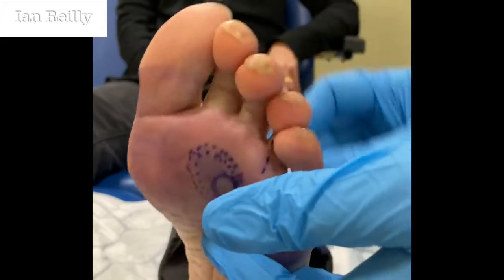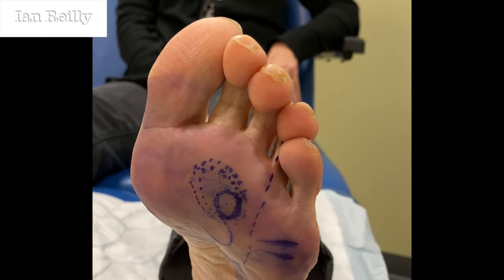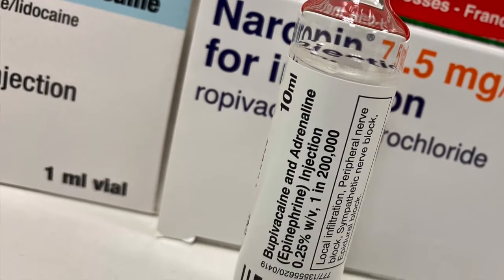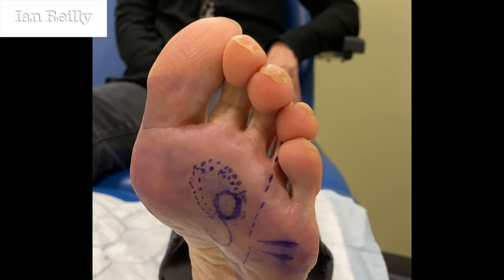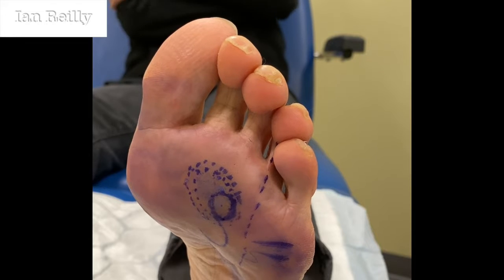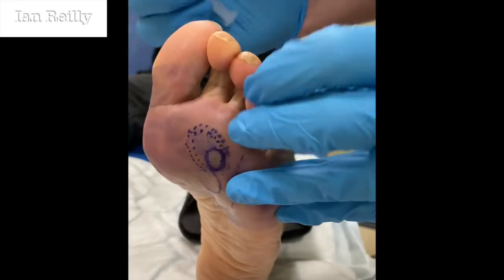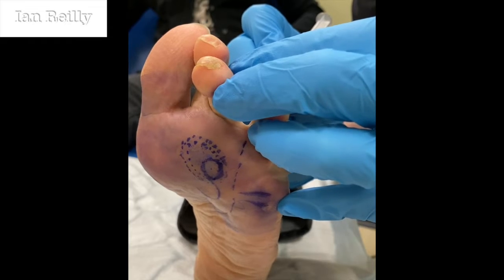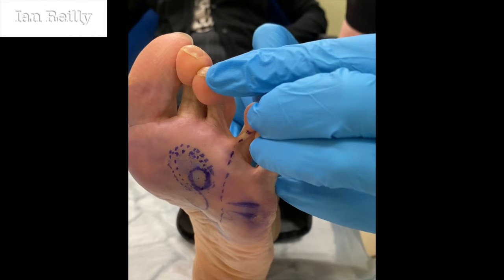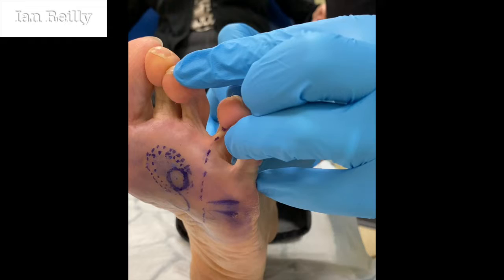We're going to prep on top as well. One of the things I like to teach is local anaesthetics. For this we're going to use a little bit of 0.25% Marcaine with adrenaline. A little scratch — three, two, one.